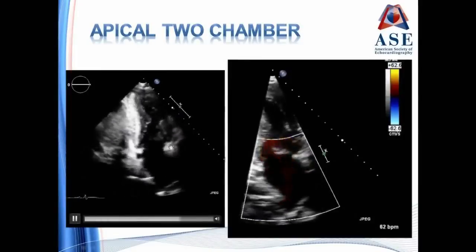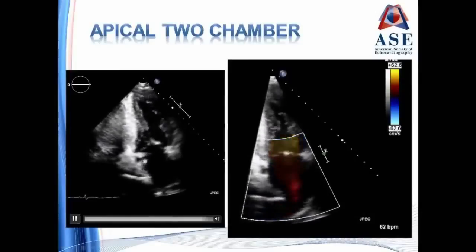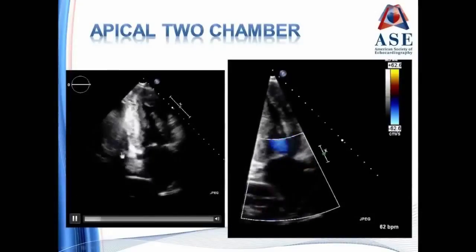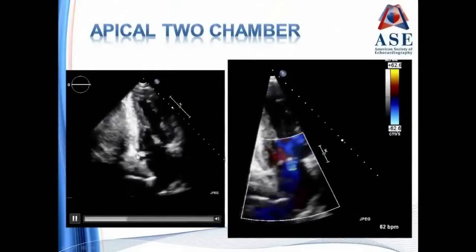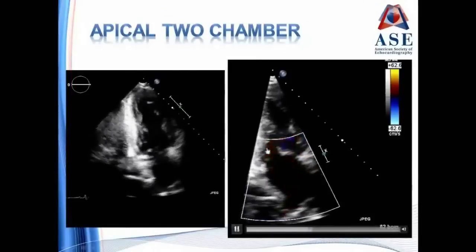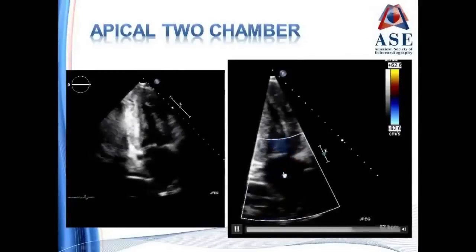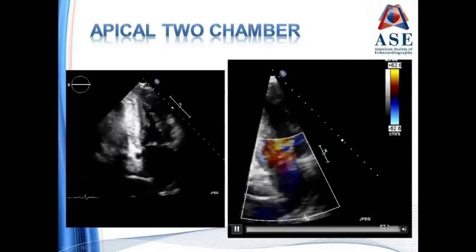And here's an example. The anterior leaflet of the mitral valve, the posterior leaflet of the mitral valve, a little piece of the coronary sinus. It looks enlarged here, but it's actually cut a little oblong. It's running in the AV groove posterior to the left atrium. And again, we can see that this patient has very trivial mitral regurgitation, but we're lined up nicely to measure velocities as we're parallel to the velocities we're interested in here.